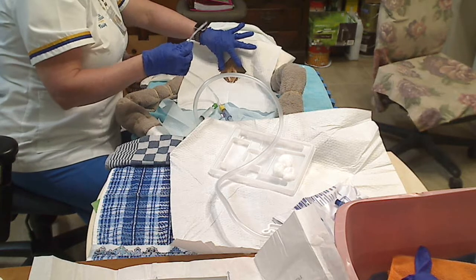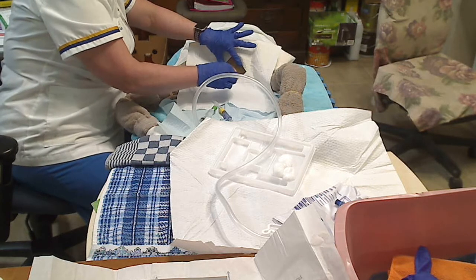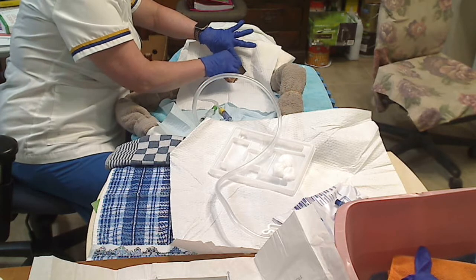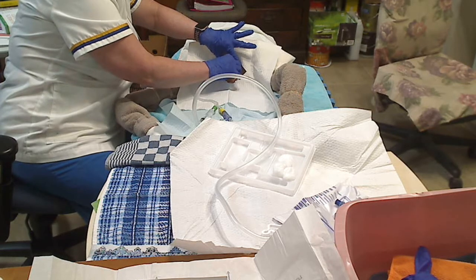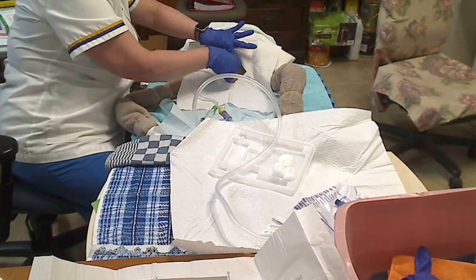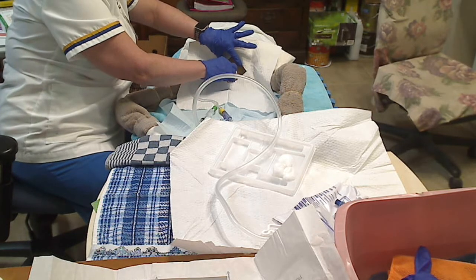Miss Anna, I'm getting ready to insert the urinary catheter now. What I need for you to do is bear down lightly, just lightly, okay? Okay. I'm going to slip the catheter into the urinary meatus. I'm going to go about 2 to 3 inches total, but I'm going to push it in until I see urine come out. I now see a small amount of urine coming into the tube, so I'm going to go ahead and push it another 2 inches in just to make sure that it is definitely within the bladder.